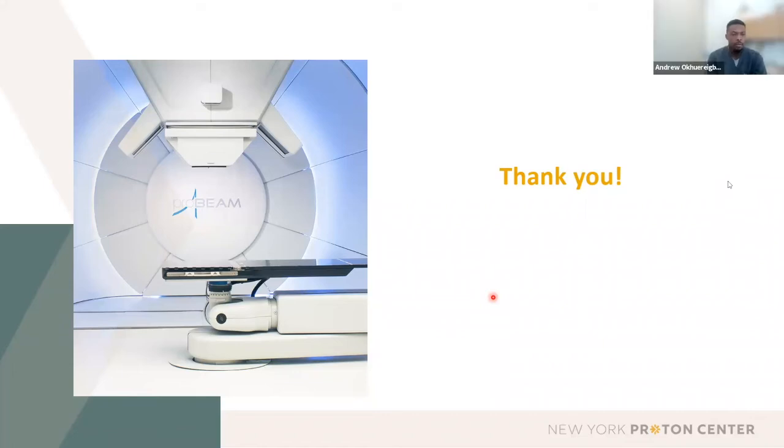Yeah, I can speak a little bit on that. So for our SDX treatments, we do a CBCT every single day. Of course, during the imaging process, we want the patient to be in breath hold while we do that imaging. The minimum amount of time our CBCT takes is about 25 seconds. So that's a requirement for our SDX patients. We want them to be able to be completely in breath hold the entirety of that CBCT image. So that's why we have that 25-second threshold. On top of that, it's important that the patient holds their breath that long, because the longer the patient holds their breath, the quicker treatment can be. If a patient is unable to hold their breath for a long period of time, they can end up being on the treatment table for over an hour just because of the difficulty they're having.